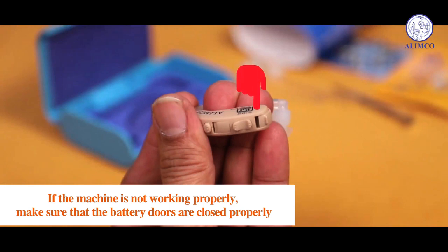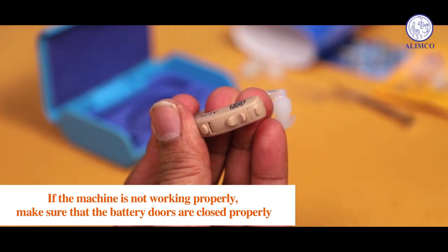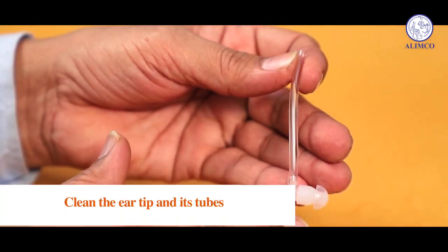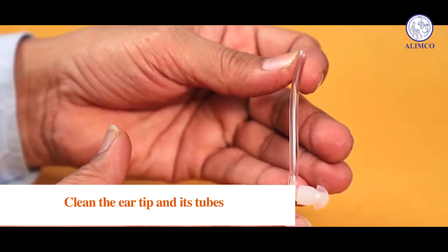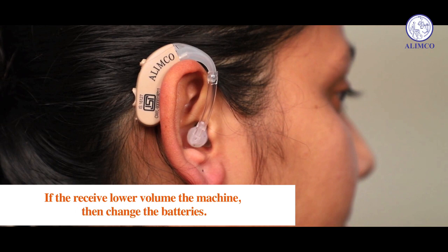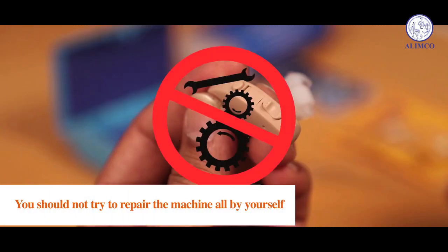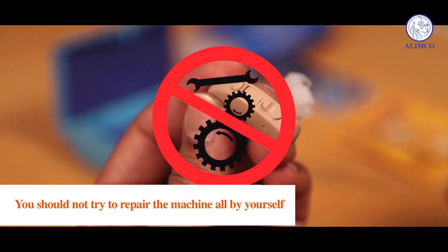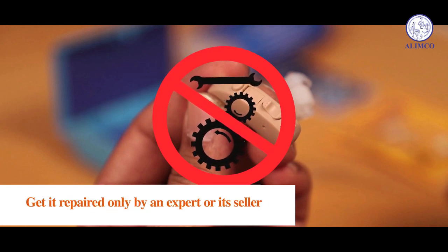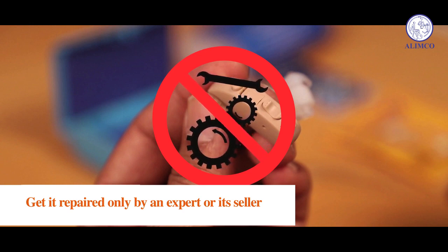If the machine is not working properly, make sure that the battery doors are closed properly. Clean the ear tip and its tubes. If you experience lower volume from the machine, then change the batteries. You should not try to repair the machine by yourself — get it repaired only by an expert or its seller.